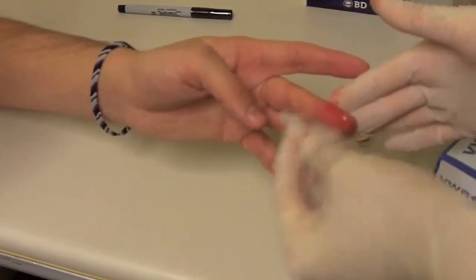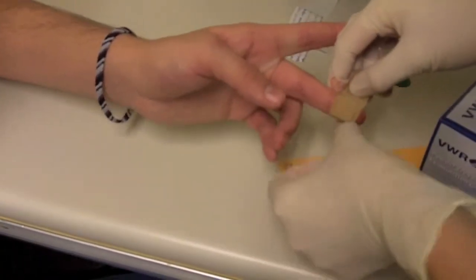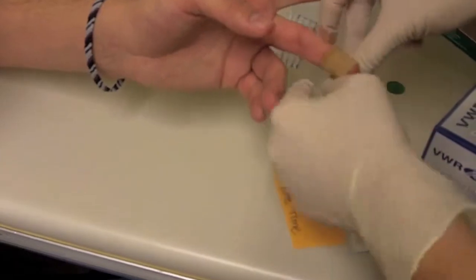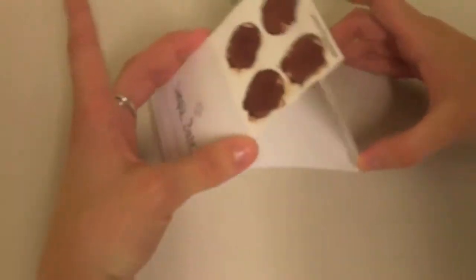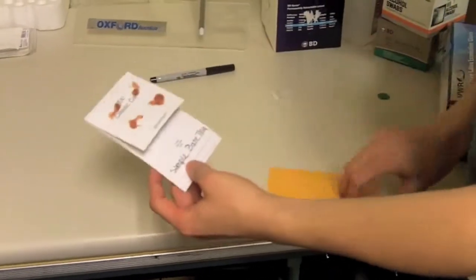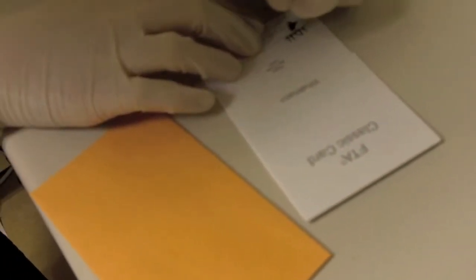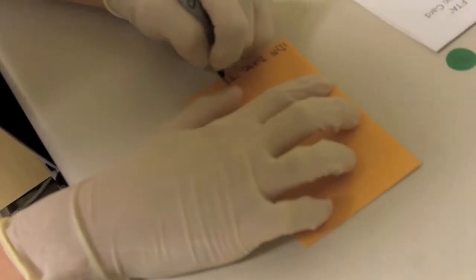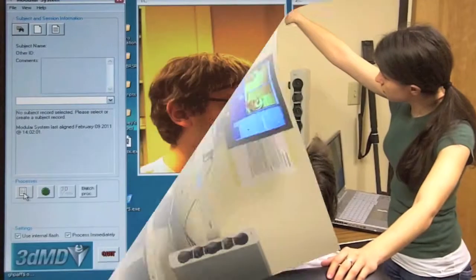After filling in all four circles, instruct the participant to clean the pricked finger with another alcohol swab to sterilize the finger. Next, apply an adhesive bandage. The blood flow should be very slow by now. If the participant is still bleeding, instruct them to hold their hand in the air and apply pressure to the finger stick site. Once done, allow the paper to air dry for approximately five minutes and place in a storage envelope. Make sure the participant's ID number is on both the bottom section of the filter paper and on the outside of the storage envelope.